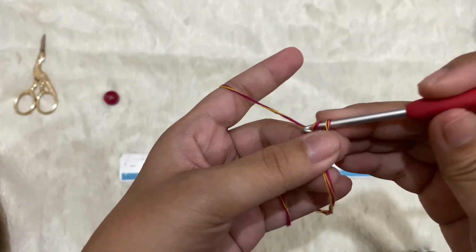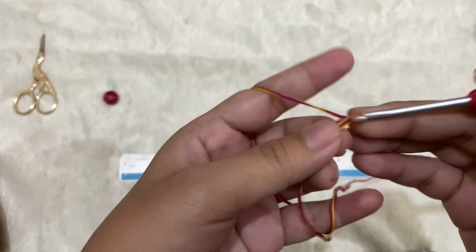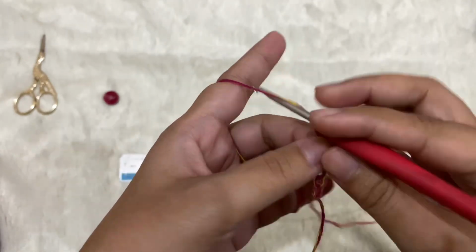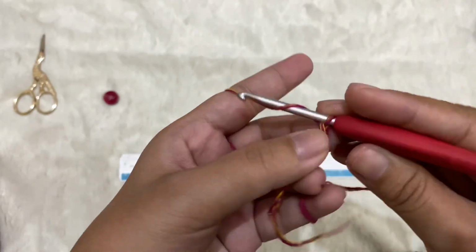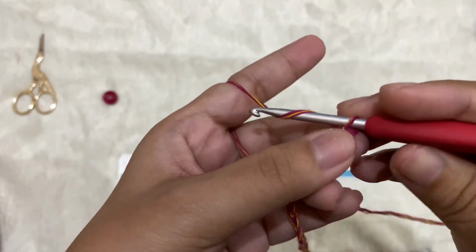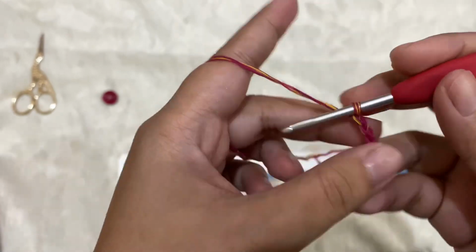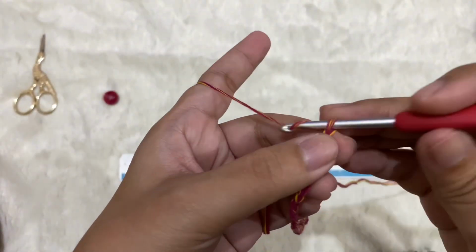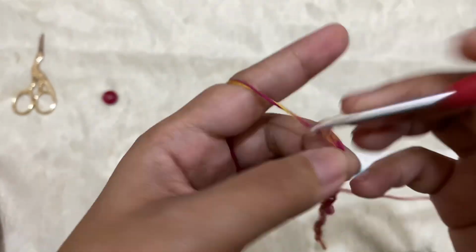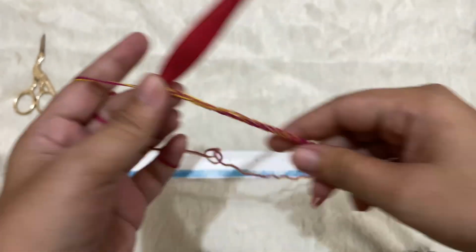So make a foundation chain. I don't have a specific number of chains, just keep making them until you reach 12 inches or 1 foot. Of course, you can count your chains. So if you're planning to make some more, you will already have a guide, and you don't have to keep measuring your chain foundation every time you start a project. For me, I need 70 chains to reach 1 foot.